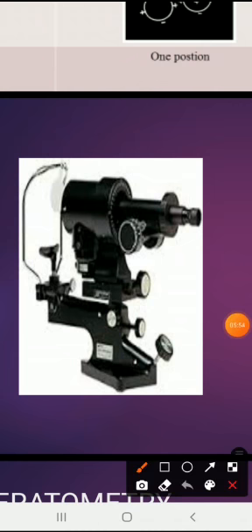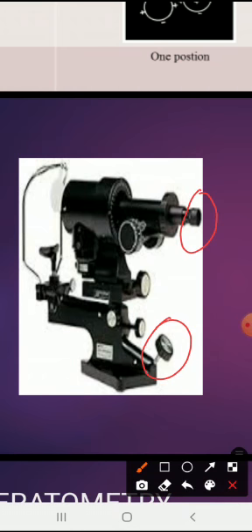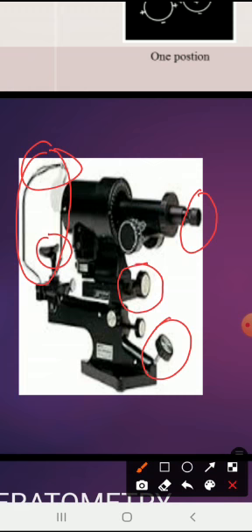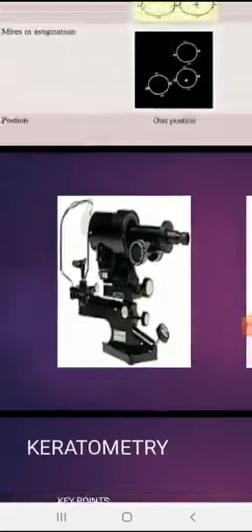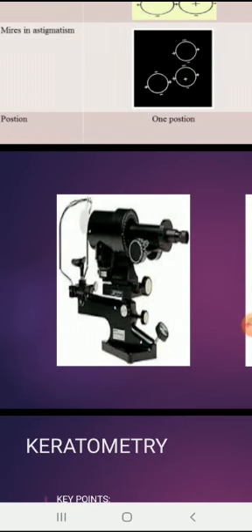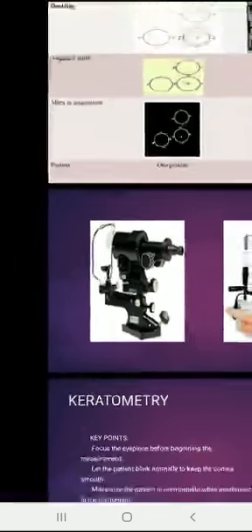Let me describe the parts of the Bausch and Lomb keratometer. There is a locking system, an eyepiece for the optometrist to observe, and the area where the patient faces the instrument, which includes the chin rest and head rest. There is also a focusing knob, and two drums — one on the left side and one on the right side. These two drums are for measuring the horizontal meridian and vertical meridian of the patient's cornea.